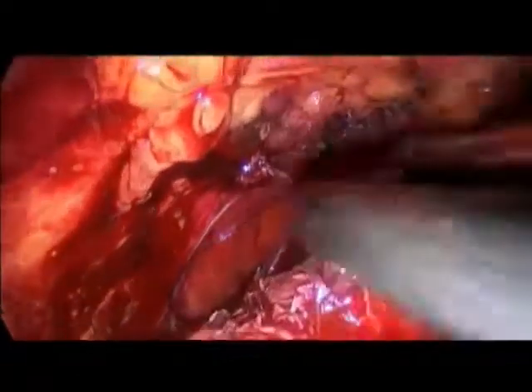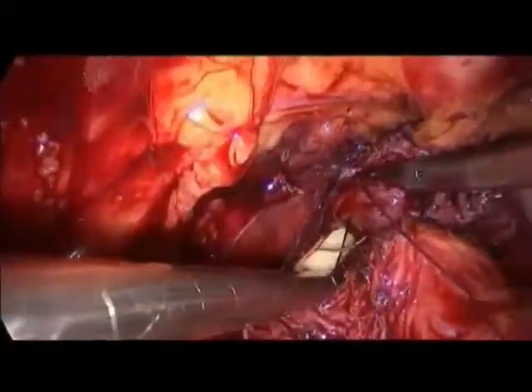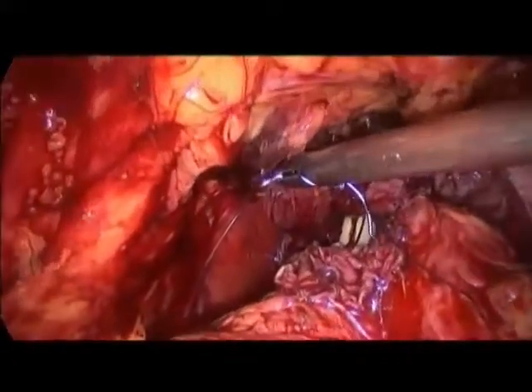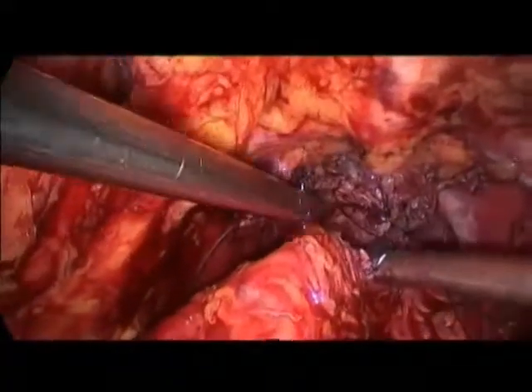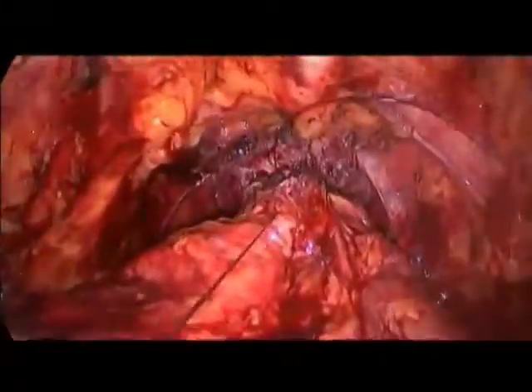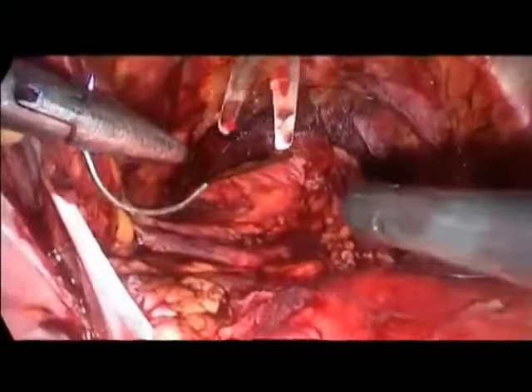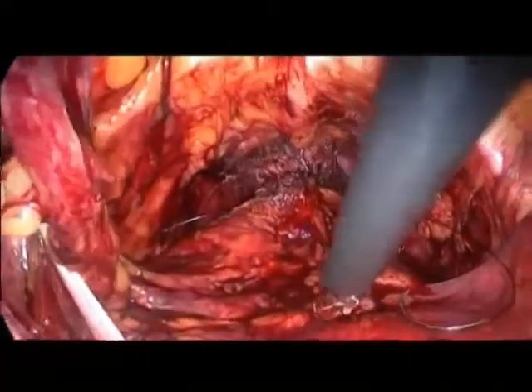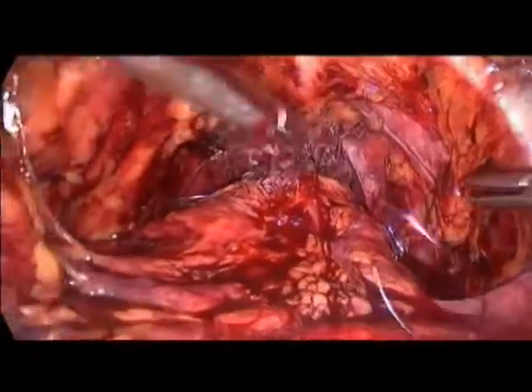What happens if one of these needles breaks? Also we had this. I just want to know what are you doing then? Then I'm shortening the thread and start with a new one and make a knot to lock at the level of the break. Because I did sometimes the other way. I just elongated with the other stitch or continued the anastomosis until I reached the thread where the needle was broken. I think we are completing now, and I will cut the first needle and take it out to ease my knotting. And just end it as usually here.